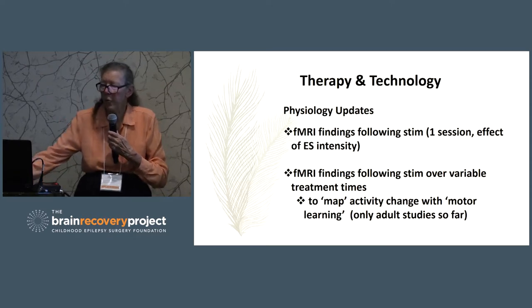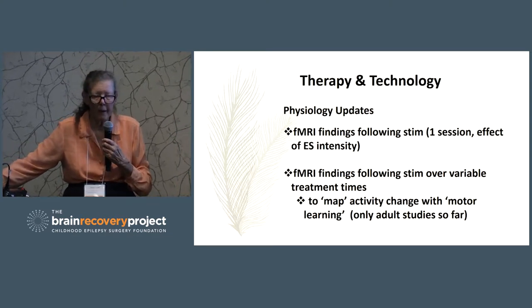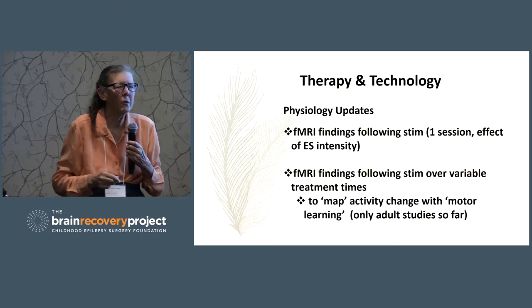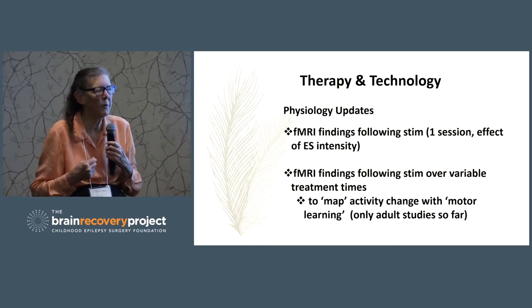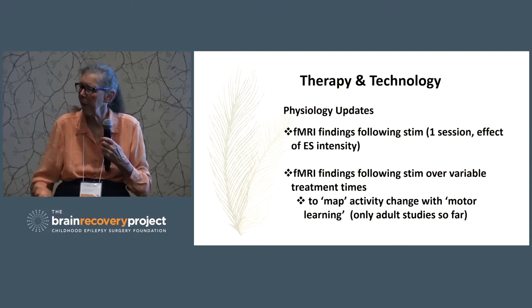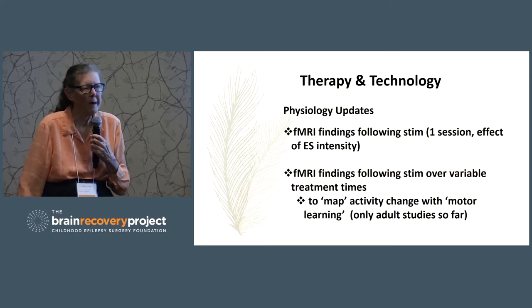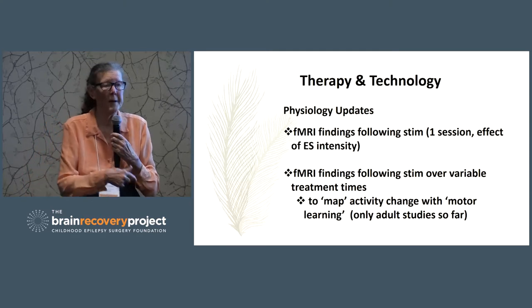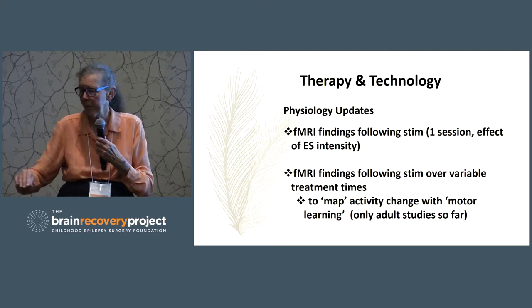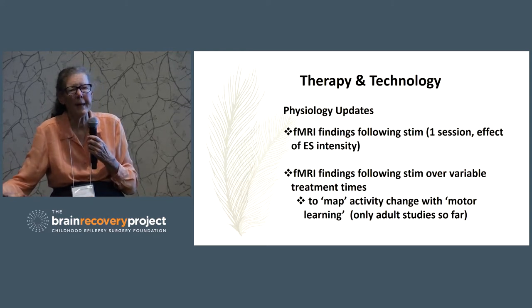to follow up with. So physiologically, what do we know that we're doing? We've known for years that with electrical stimulation, we're getting spinal cord activation of spinal reflexes. So for the spasticity treatment, we use what's called reciprocal inhibition. So if we've got a spastic biceps, we go to the triceps. If we drive the triceps, it will inhibit the biceps. Okay? So it's reciprocal. And it works on virtually everybody. So that's a wonderful technique.